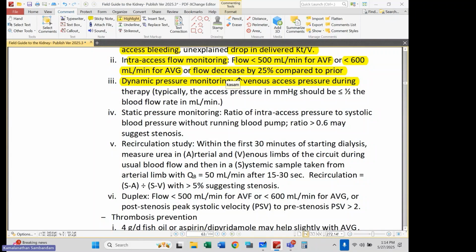Now, that's as long as you have normal or standard needles. Right? In a new stick, you may be using only 17 gauge needles. You would expect access pressures to be higher when you're pushing blood through a very narrow needle, right? So with standard needles, if you're running 400 blood flow and you're seeing access pressures of 200 or better, you should be reassured by that, okay? If you're running 300 pressures on a 400 blood flow, that's potentially a problem.